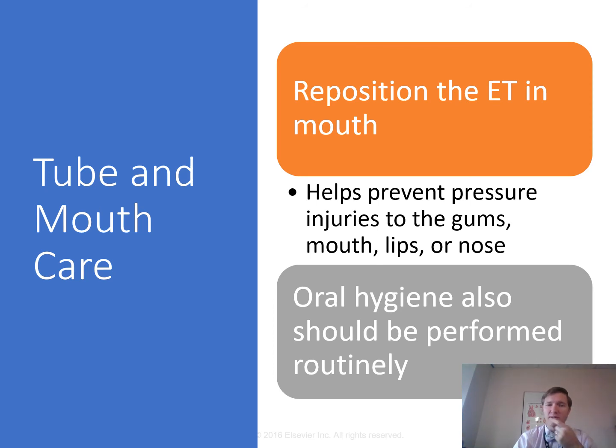Oral hygiene should be done before we move the tube around, and things like deflating the cuff or checking cuff pressures, to avoid any aspiration in there.